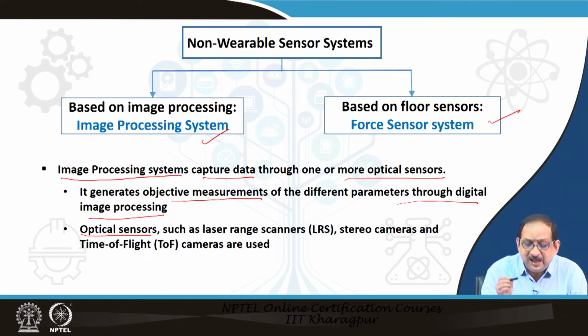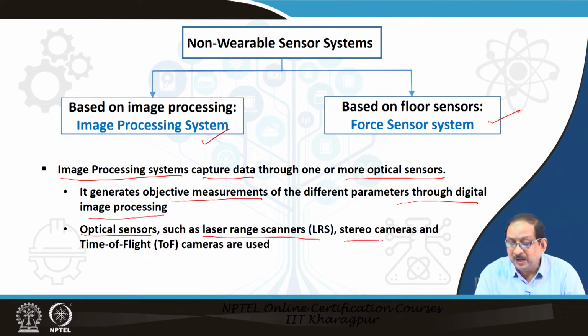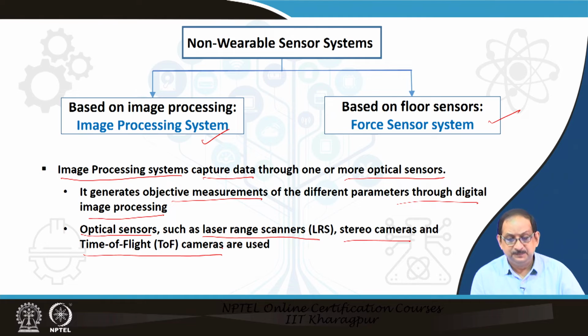It can get information from optical sensors such as laser range scanners, stereo cameras, and time of flight cameras, which are used as optical sensors.